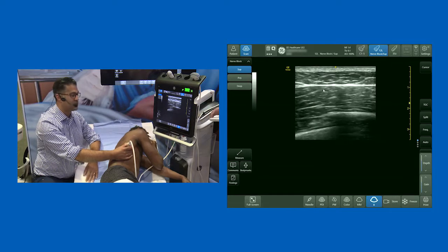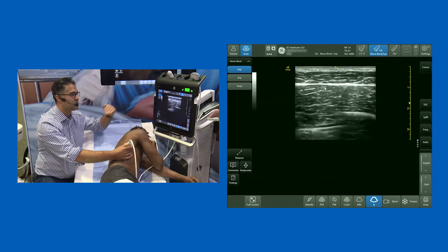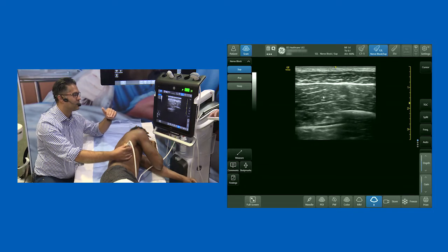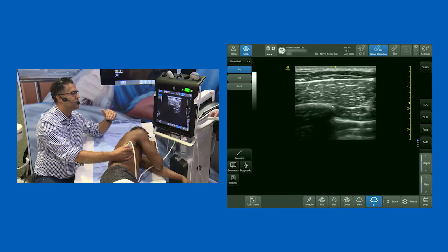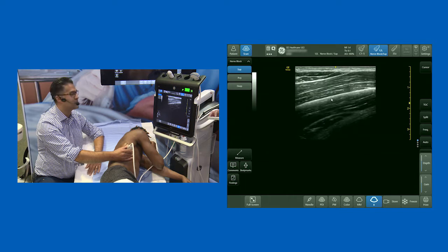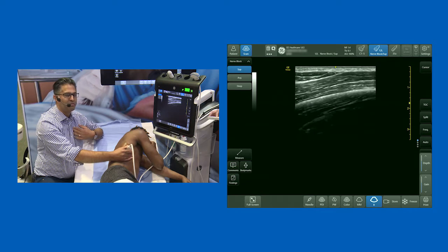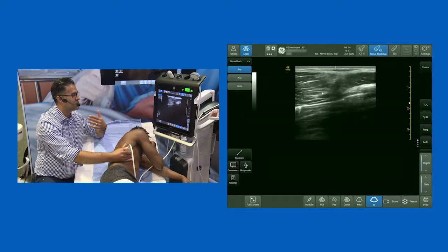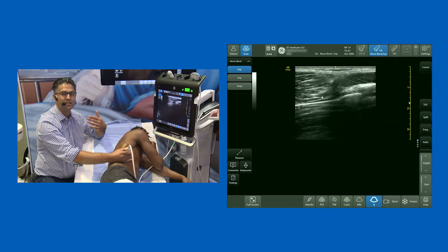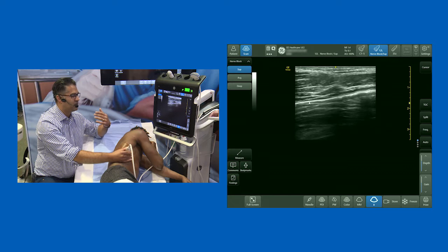The other approach for serratus plane blocks — and you'll certainly see emergency physicians do it — is to inject below serratus. Rotating the probe and scanning along the long axis of the rib, they aim to inject local anesthetic in the plane just below serratus on top of the rib. Personally, I don't like anything that has the potential to take me in close proximity to the pleura, and in this position serratus lies directly on top of the pleura.